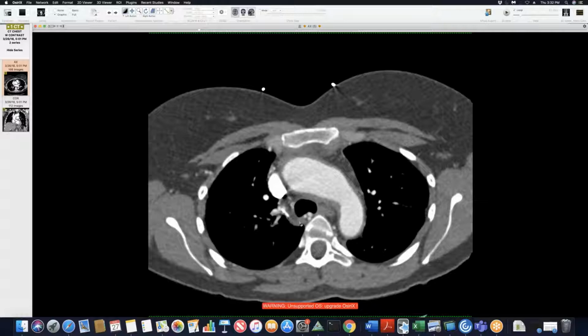The other case presented, yeah, it was pre-COVID. She actually had a PE years ago, or a couple years, maybe it was a year ago, but pre-COVID she had a PE, and that's why it was originally thought to be maybe. And she had some infarcts. Maybe this was chronic PE, but there was too much thickening in the wall. I'll bring them next week. It'll be worth talking about.